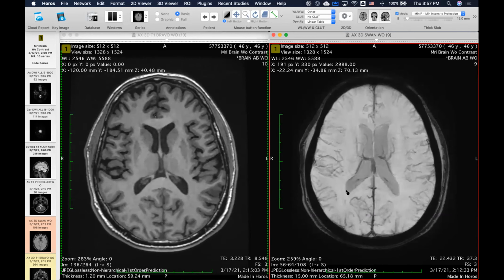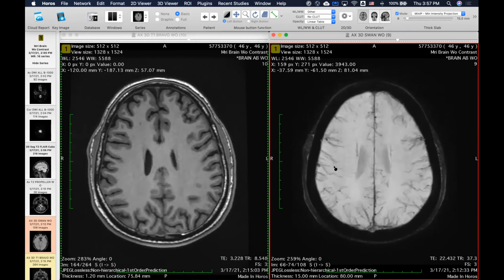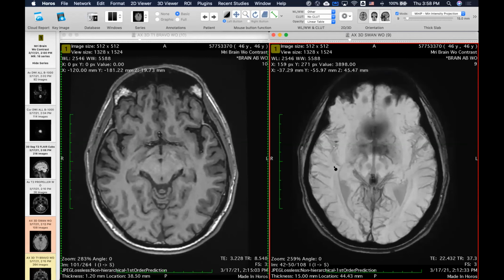And because of T2 star decay, the veins, remember, have more deoxygenated blood. And so they have a susceptibility difference. Their T2 star is shorter, and therefore you can see the veins very nicely on this. See how beautiful? And so this is used to, for example, detect microbleeds. So when you have microbleeds, you have deposits of hemoglobin, which would pretty much result in large susceptibility artifacts.